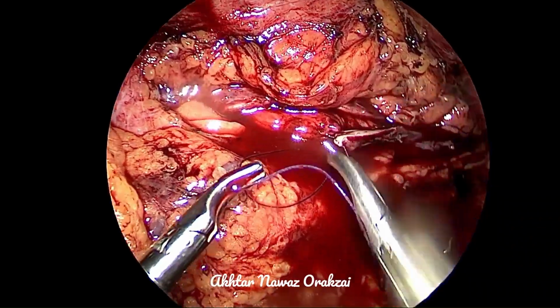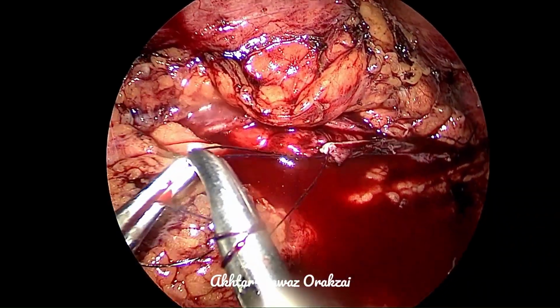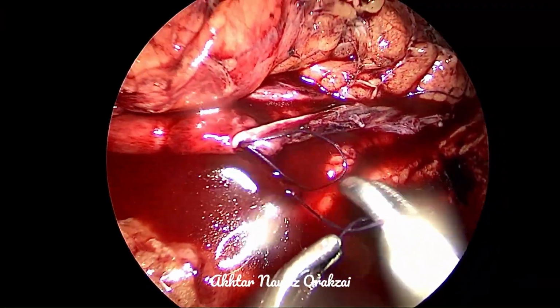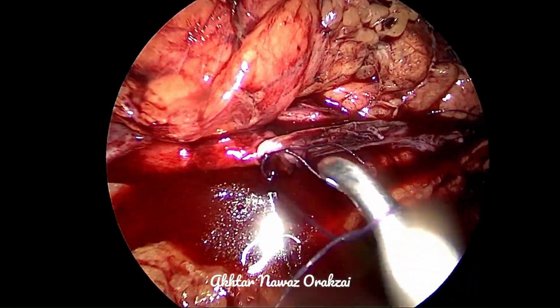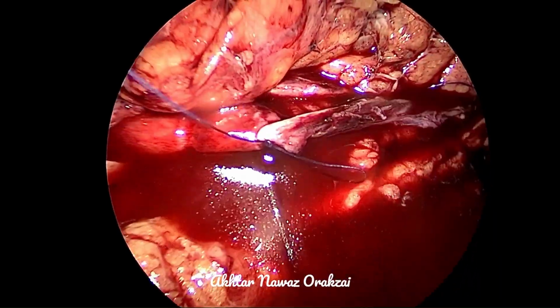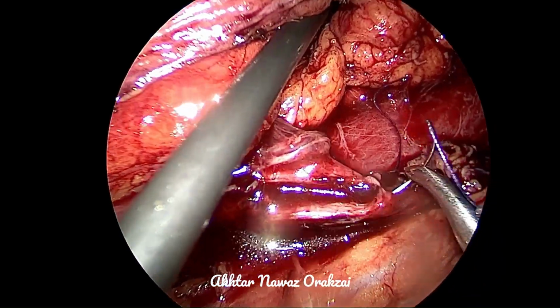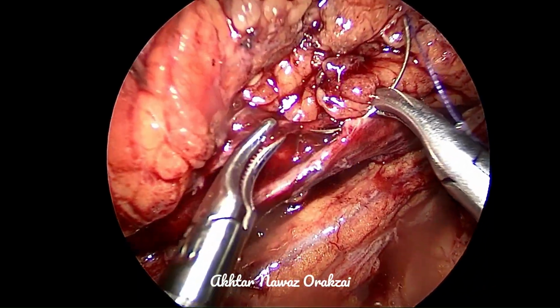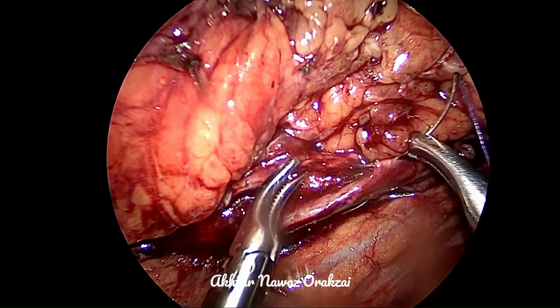However, knotting is good because we don't want the suture line to get loose and lose the water tightness. So if it is not watertight and there is leakage of urine, this leakage of urine is going to lead to a recurrence of the PUJ obstruction, most probably due to inflammation.